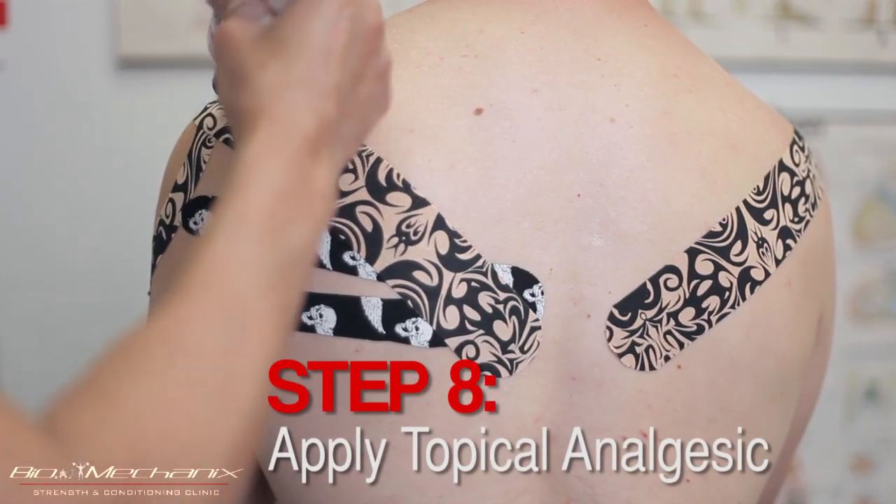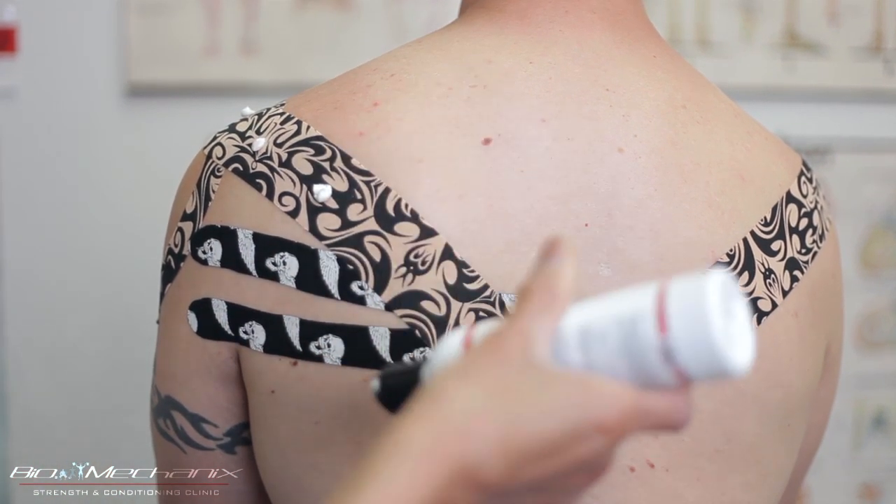After Luke's tape is all set and put on, I'm going to apply some Rock Sauce on him — this is an added benefit.